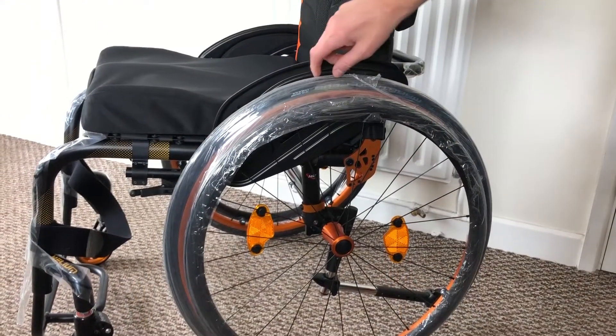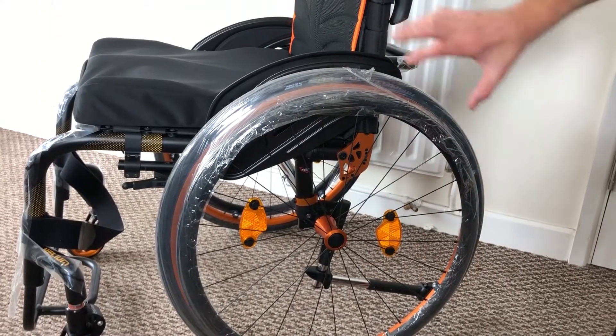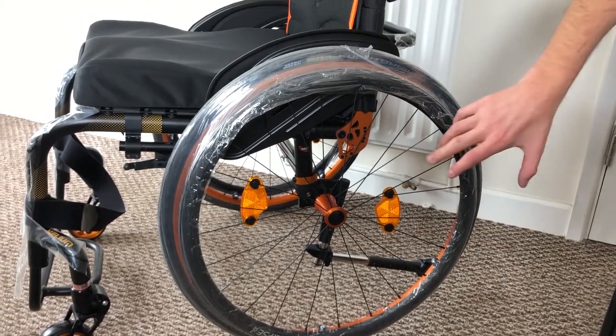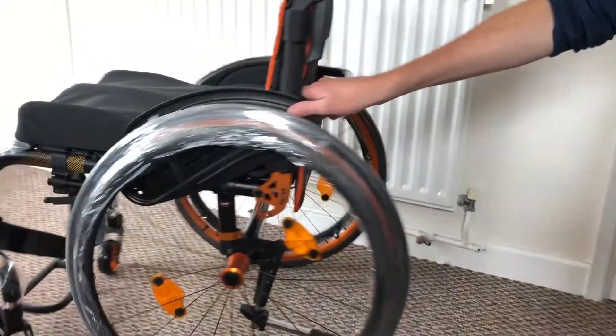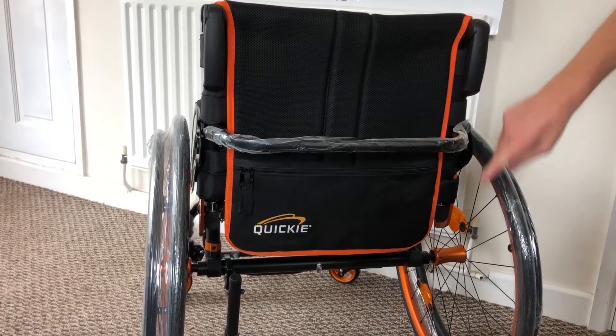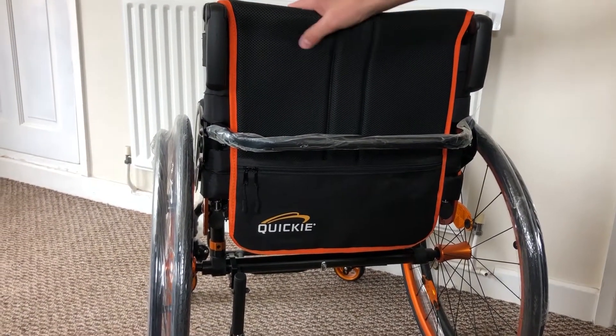On the wheels we've got the orange or gold rim along with the orange hub and the orange back bracket, so the contrast is really nice, along with the binding which is the stitching on the edge of the Exo Pro backrest.